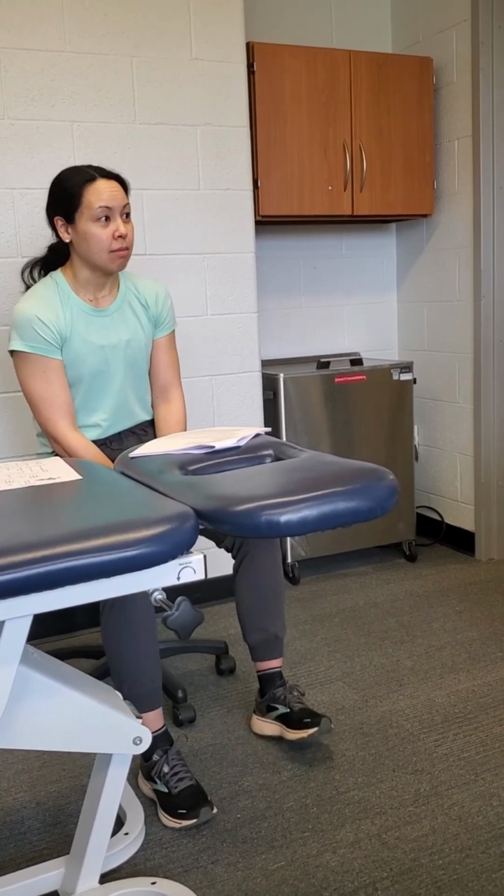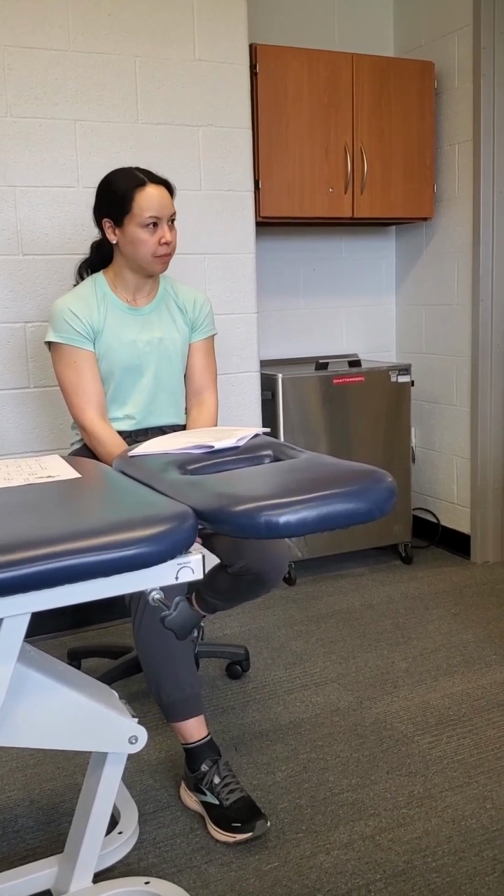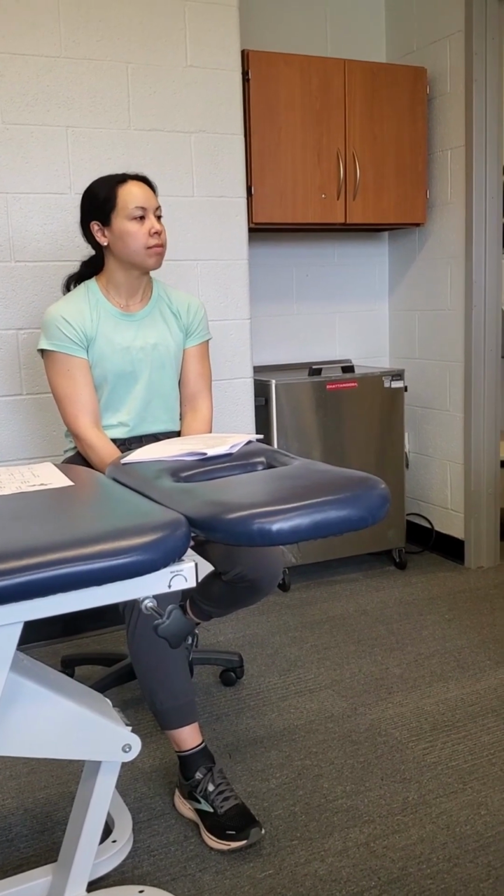Okay. But again, in my experience you do body weight of the movement that first session, because they're probably not going to tolerate this being on that long anyways with just body weight. Totally. Then they know what to expect. And the next time around, you add a pound maybe for the extension. Okay, 2 pounds maybe, right?